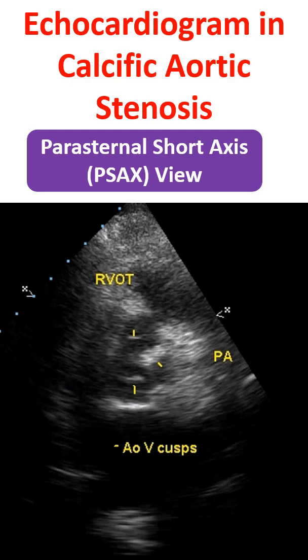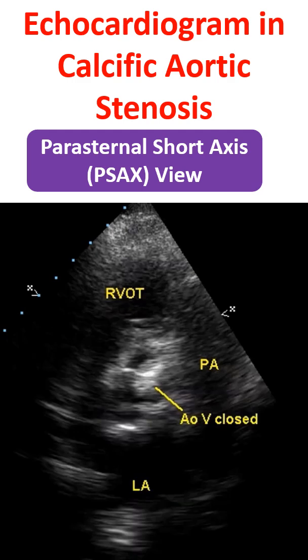RVOT: right ventricular outflow tract. PA: pulmonary artery. Parasternal short axis view at the level of the aortic valve showing the aortic valve in closed position with significant thickening and calcification. The valve appears tri-leaflet rather than bicuspid.